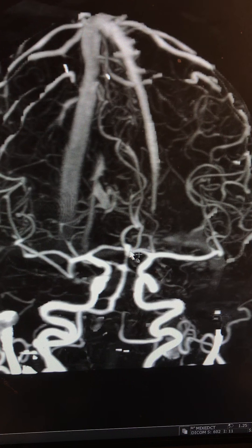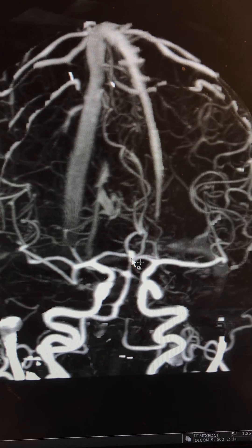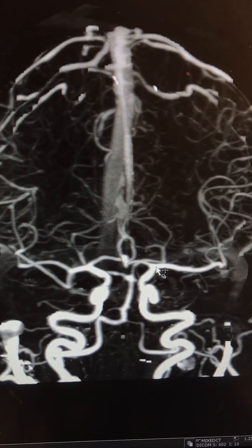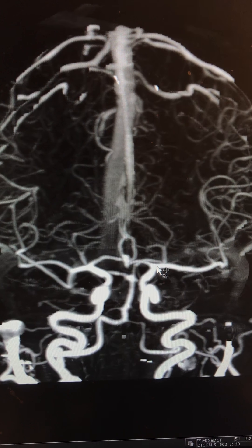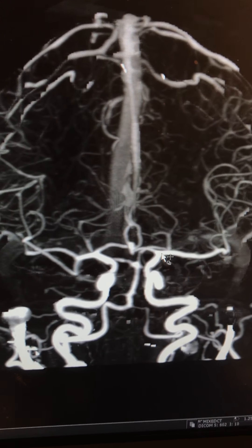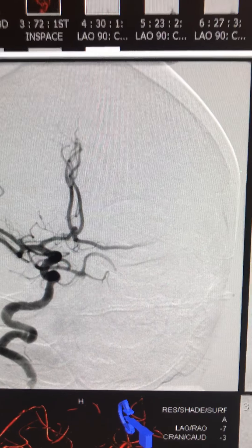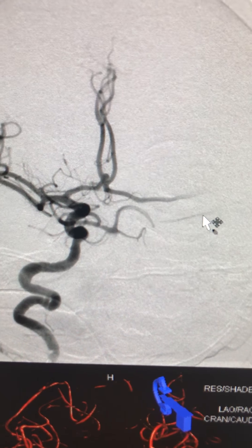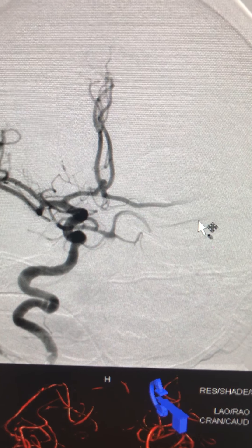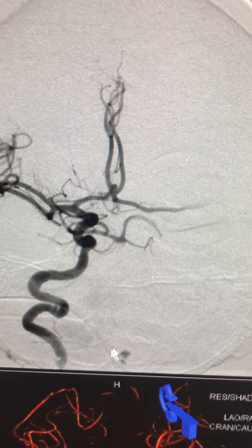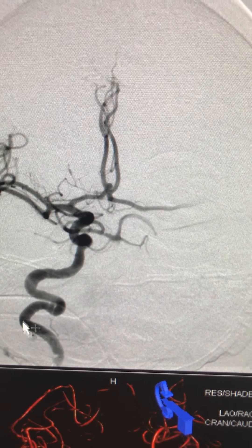The aneurysm is at the junction of A1 and A2, predominantly from the right side — this is the left A1 — partially involving the anterior communicating level as well as the A1-A2 junction on the right side. We brought the patient for angiography and prepared her with anti-platelets in case we needed to do stent-assisted coiling, given the wide neck.